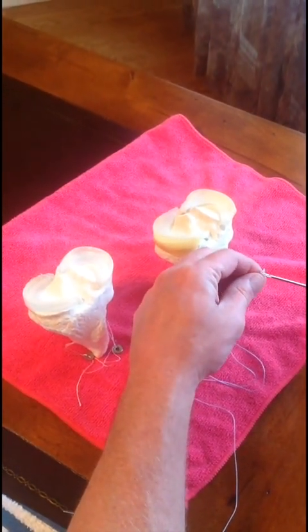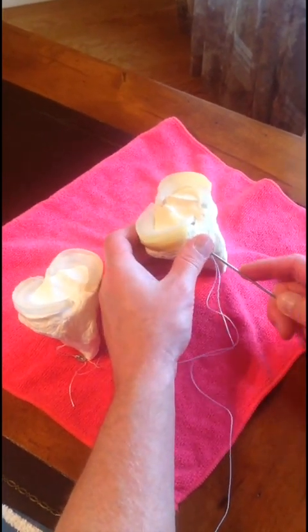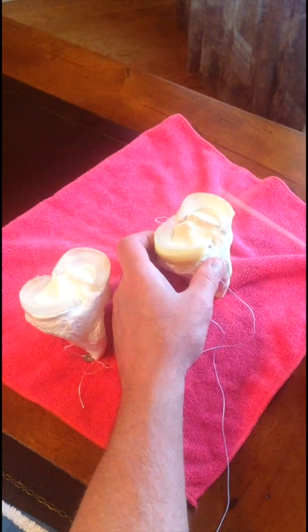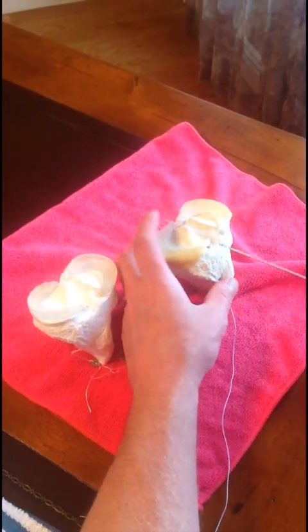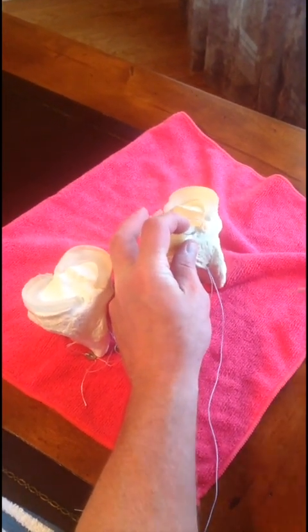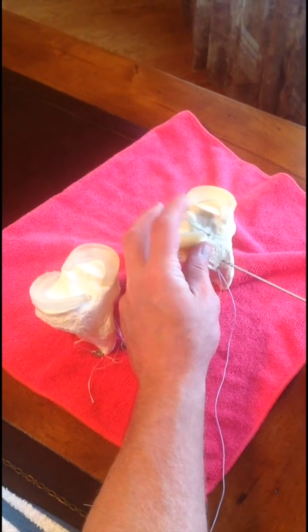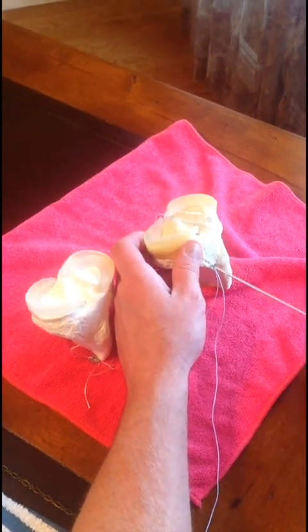In this case I'm going to go ahead and drill up with a commercial pin. I'm going to do this before doing an ACL tunnel or doing a suture pass, so I want to make sure that these tunnels are correct and don't vary from the intended target. Once I've got those passed, then I'll pass my sutures through the posterior horn and then come back and later tuck up a suture loop to pull the sutures back down into their respective tunnels.